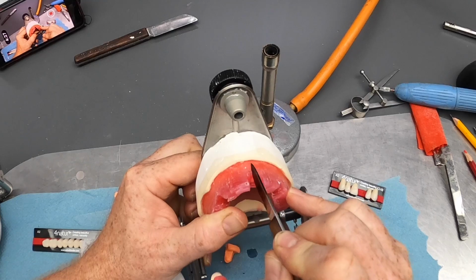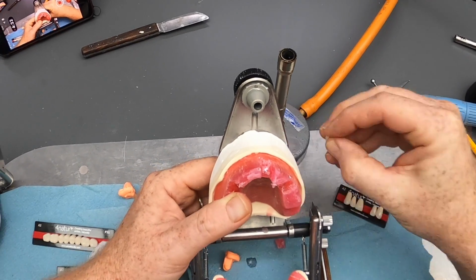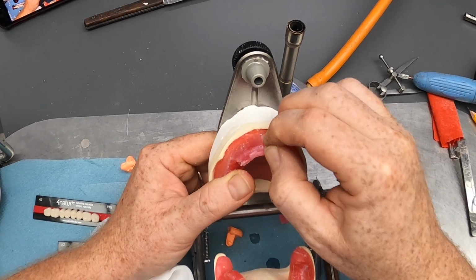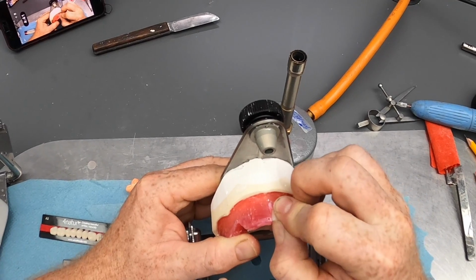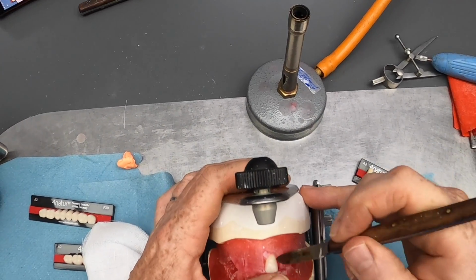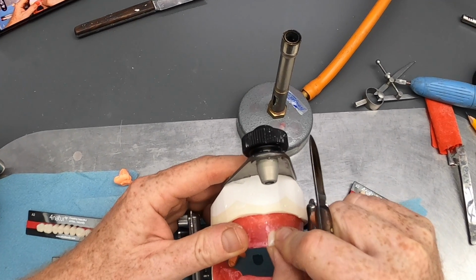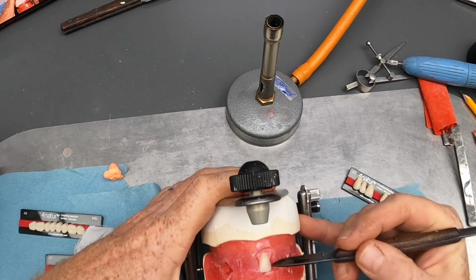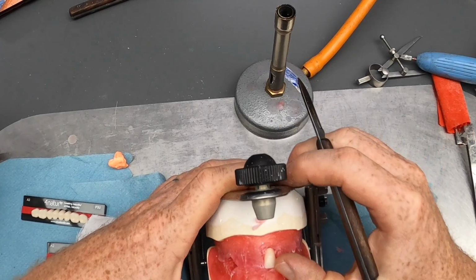We've still got the wax adjacent to that area to use as our guide, and we can take our tooth, pop it into place, lining up the labial surface with the block and the incisal edge with the occlusal plane, like so. Position it in. We're not worried about getting the waxwork tidy around the tooth at this stage. In fact, it can hinder more than help if you've got too much wax, because it makes it difficult to move the teeth.